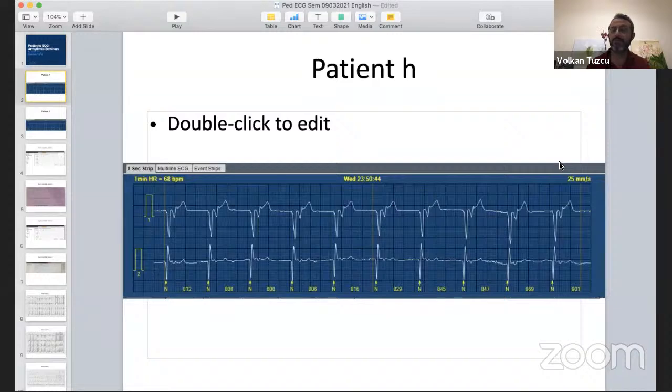Junctional rhythm leads to a narrow QRS, right? Let's say it's from the AV node, or the junction from the His bundle. There has to be a bundle branch block, not aberrancy, but bundle branch block. If the patient has an underlying bundle branch block and goes into junctional rhythm, your QRS would be the same QRS as baseline.